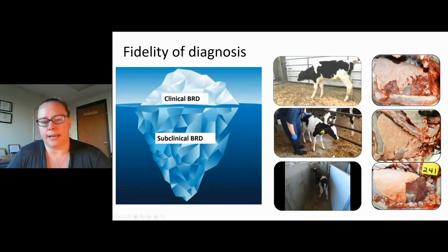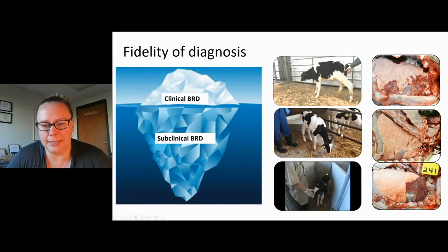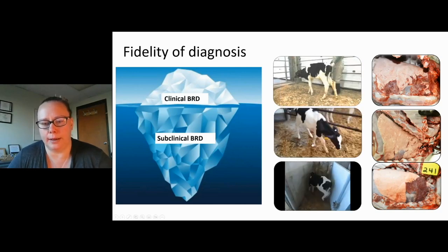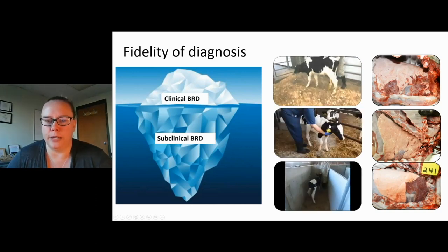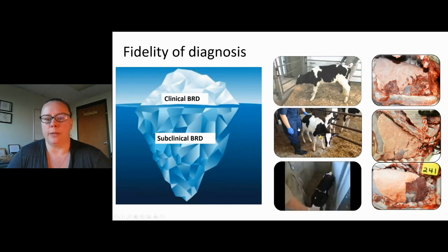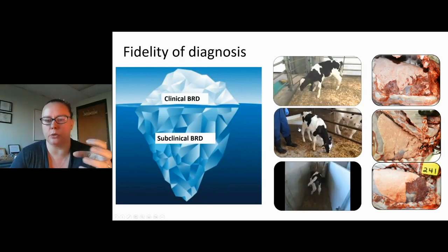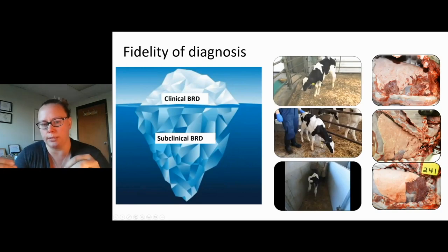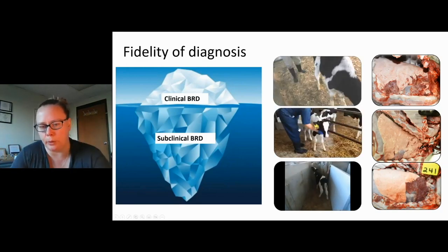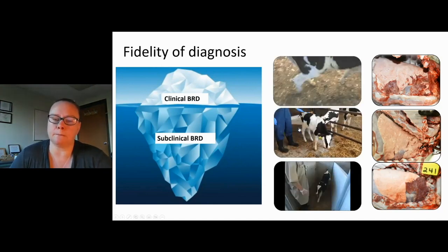Well, then we have this calf in the middle. You'll notice, hopefully the video is playing at the same time as mine, that I just induced a cough in this calf. This is a 10-week-old calf. You see she's got droopy ears. I'm inducing a cough in here. She coughs multiple times. So based on our University of Wisconsin calf health score, the clinical respiratory score, she is positive for clinical respiratory disease. She has multiple inducible coughs, and both ears are droopy. Okay, so she has visible signs of respiratory disease.